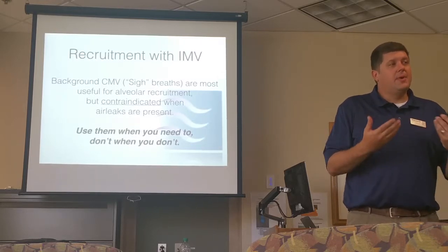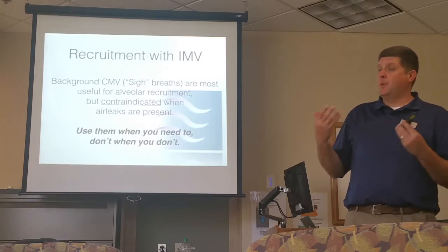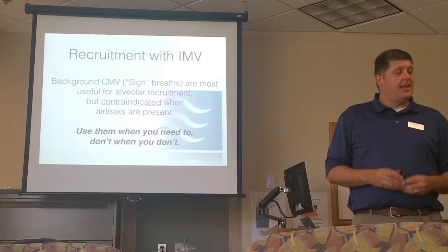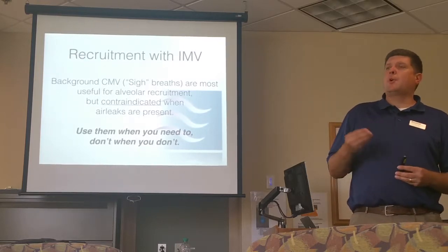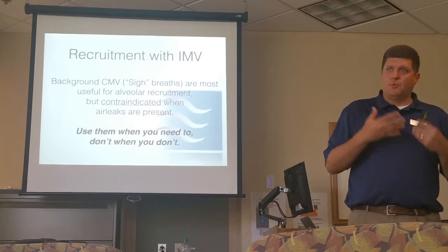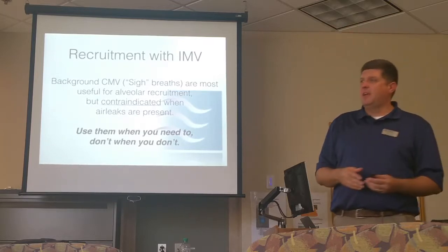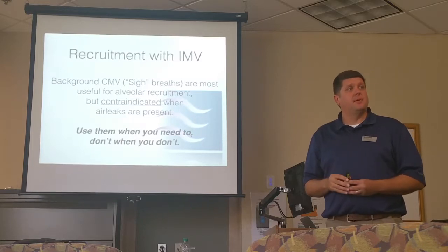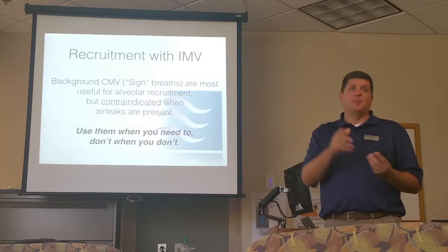But if we do have an increase in oxygen requirement, we get an x-ray and we do have atelectasis, okay, then I can use the background rate. But the idea is to use them temporarily. Think of it as a temporary lung recruitment maneuver. 15, 20, maybe 30 minutes. Recruit the lungs back, get our sats back to baseline, and then bring that back down towards CPAP. Now on the servo, it's a little tricky because you can't just turn the rate knob to 0.